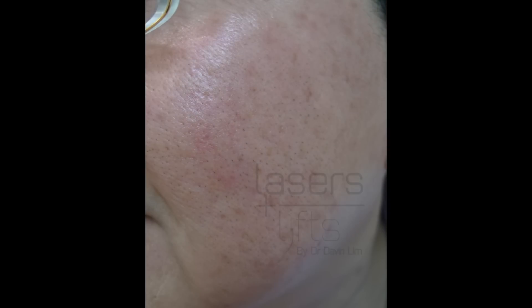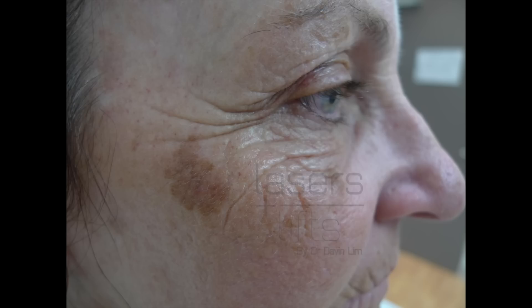This Asian gentleman had a lot of seborrheic keratosis on his cheeks. I used a curette coupled with an erbium laser. You can see what it looks like a few weeks later. The redness will fade over the next month or so — it's a nice, precise method.